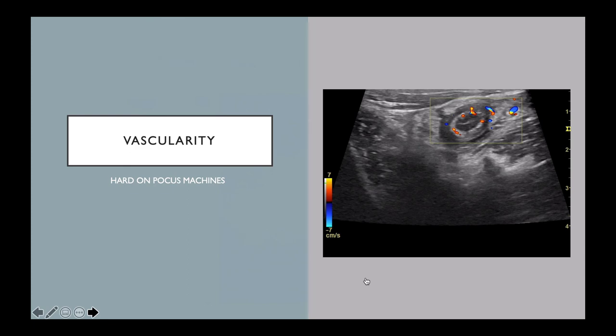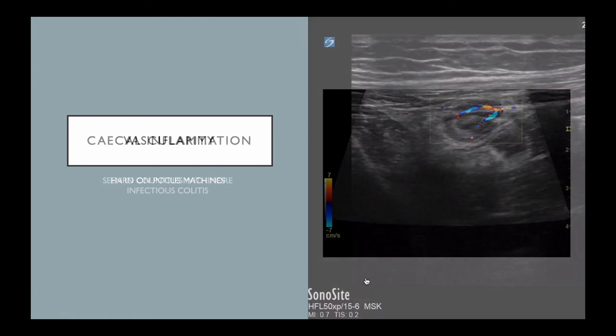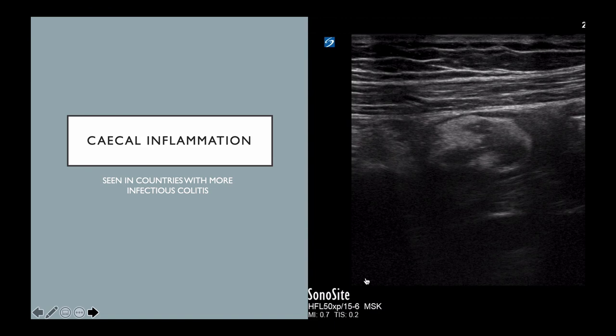Vascularity is often mentioned by our sonographer colleagues, and I think that's because they have very good machines, but it can be quite hard to show increased vascularity on our point of care machines. Another change that you may see is cecal inflammation, where you get some very odd looking swollen, engorged large bowel.